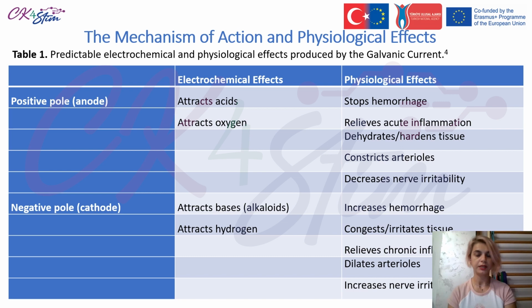So to identify the negative pole and negative lead, an approach involves immersing the leads in salted water and gradually increasing the amperage until bubbles emerge at the leads. The negative pole attracts positively charged hydrogen ions, causing the accumulation of numerous smaller bubbles, distinct from the positive pole and lead.